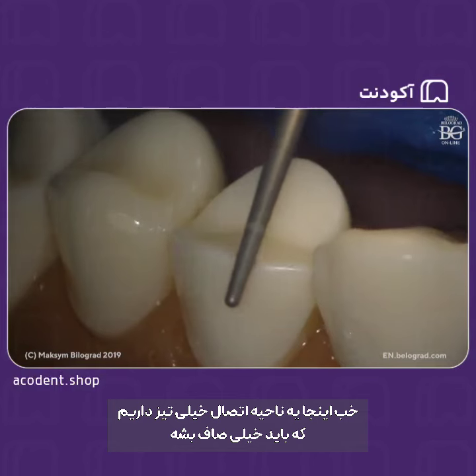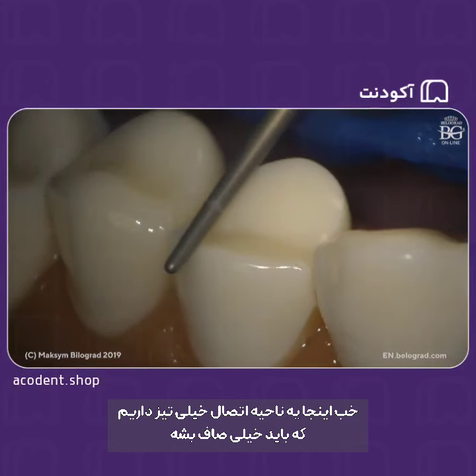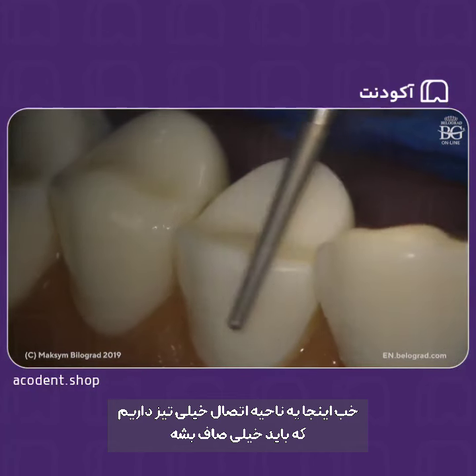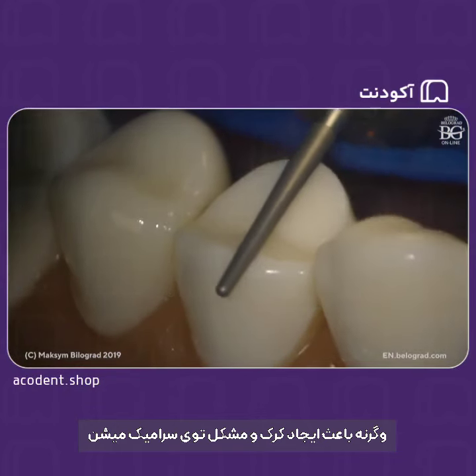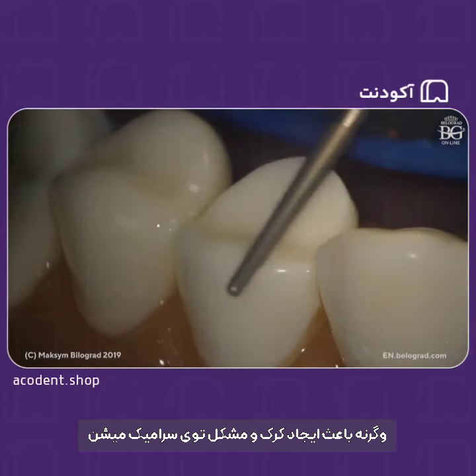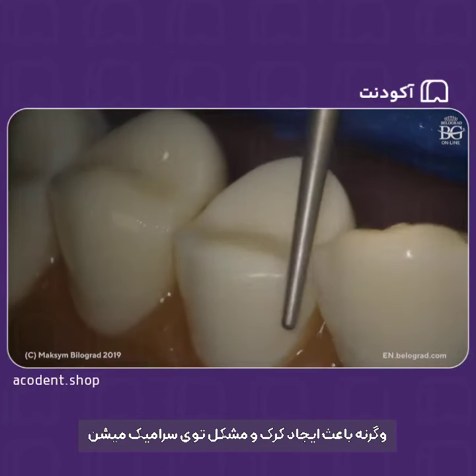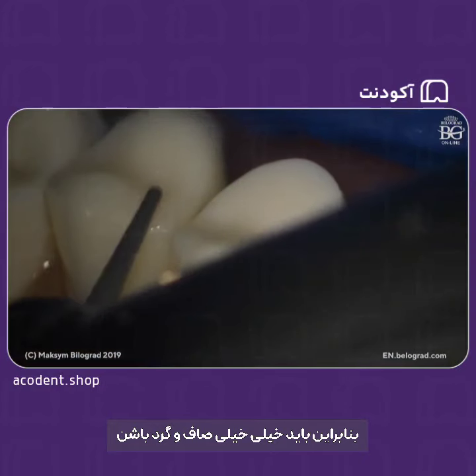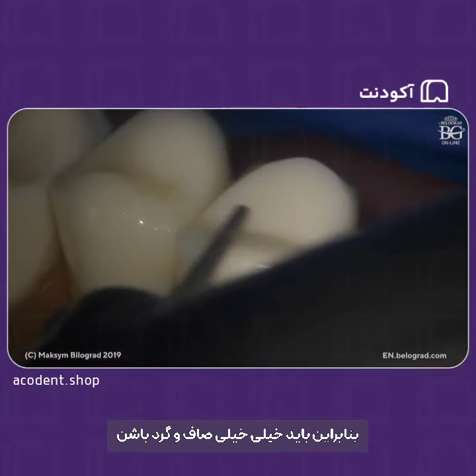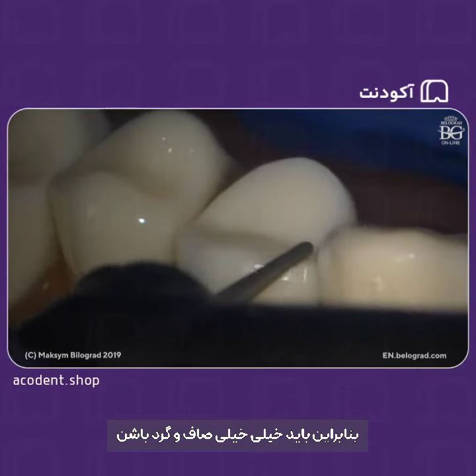It has to be super smooth, not super sharp. Otherwise, you may expect cracks and problems with ceramic restoration. So that has to be really smooth. Smooth and rounded.